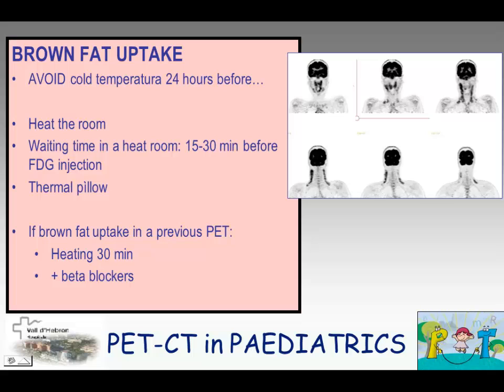And if we know that in a previous PET the girl had a brown fat uptake, then we ask the family to come half an hour before the injection, in order to prolong the heating time. And then, yes, we use the beta blockers.